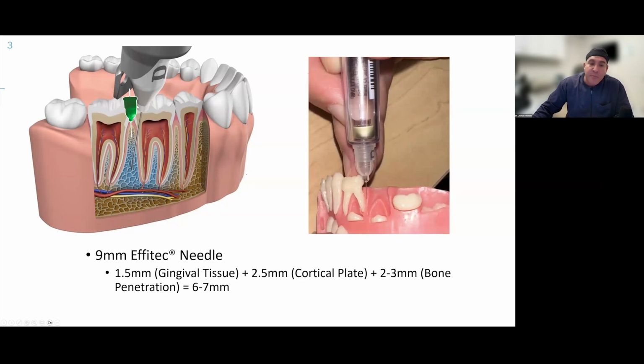And when you deliver with a 9 millimeter needle on a patient that's in a full permanent dentition, you are not likely getting osteocentral delivery of your local anesthetic. You're numbing just this interseptal bone. What happens is we know that in that area, it's not the same blood supply, and you're going to have an issue with how many teeth you can get numb. Anybody 14 and older that I can deliver an interosseous injection with, I consider it a bonus.